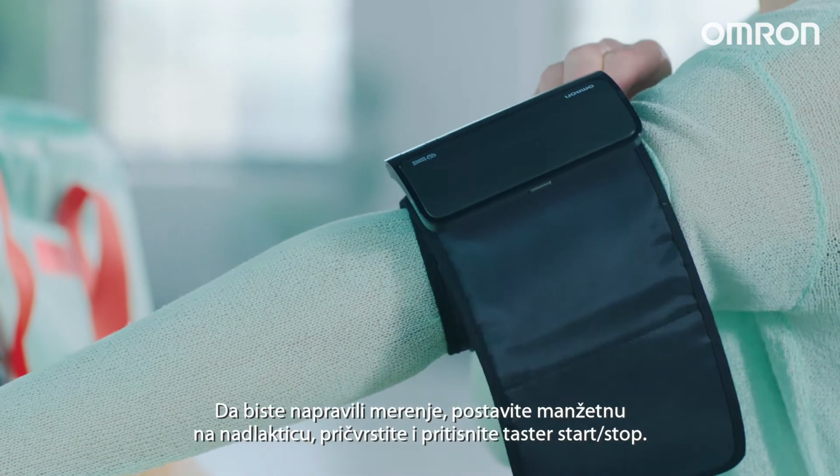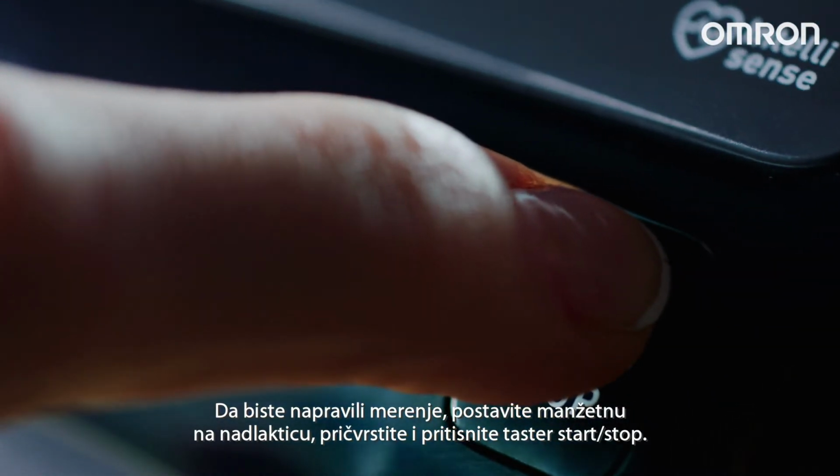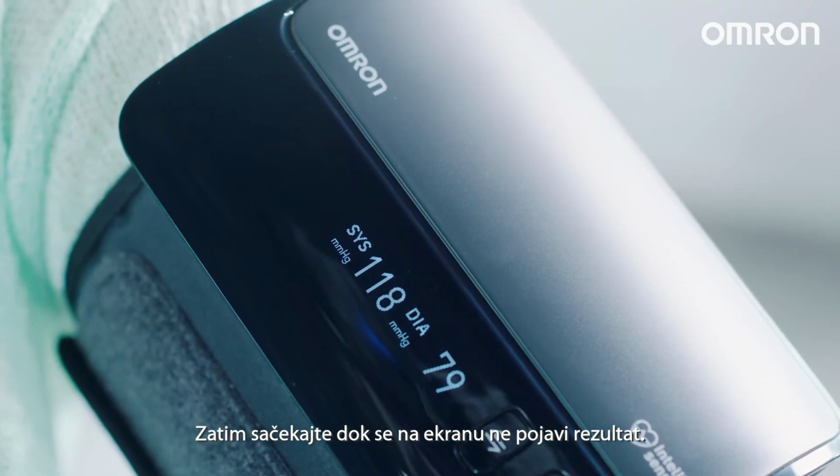To take a measurement, place the cuff on your upper arm. Secure it and press the Start/Stop button. Then wait until the readings appear on the screen.